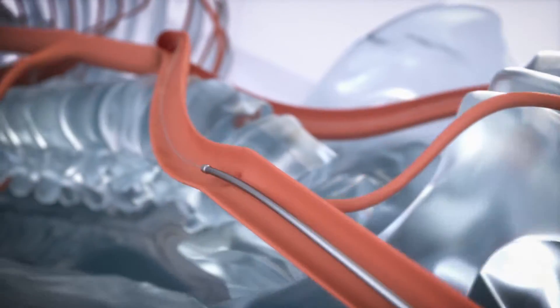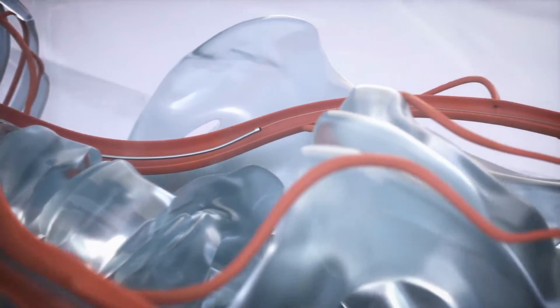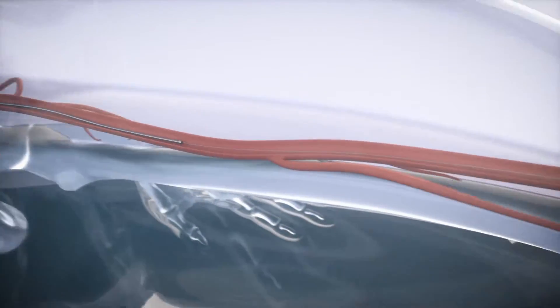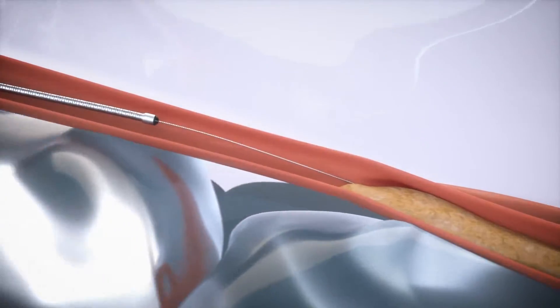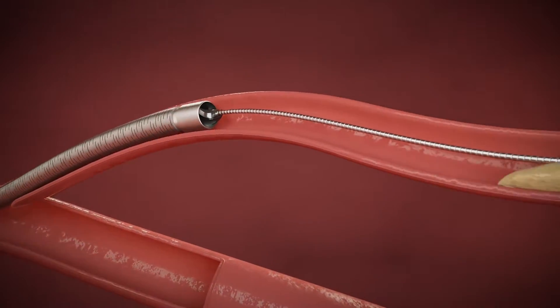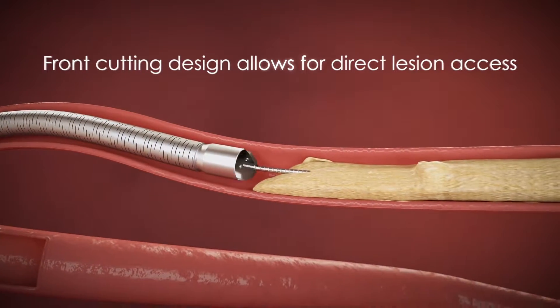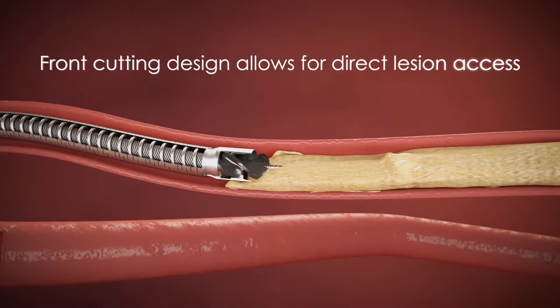The catheter's over-the-wire design provides support to aid pushability and deliverability and has been proven effective in navigating tortuous anatomy. Because the cutting element is located on the distal end of the catheter, the Phoenix can immediately begin treating highly stenosed lesions without having to first pass a nose cone.